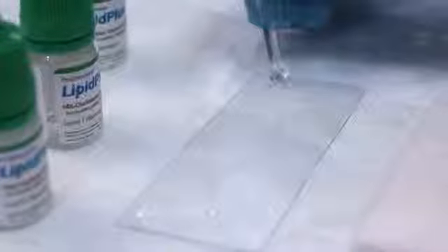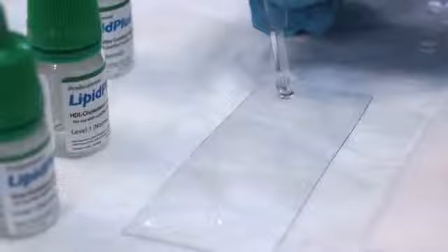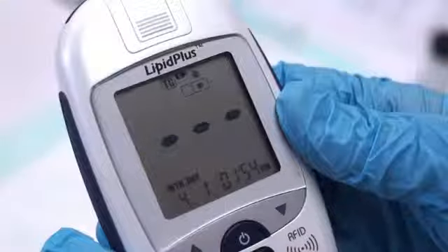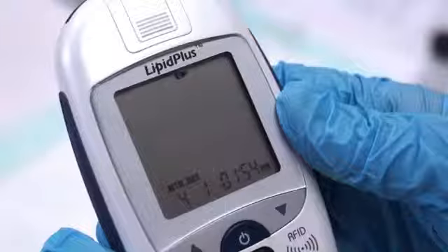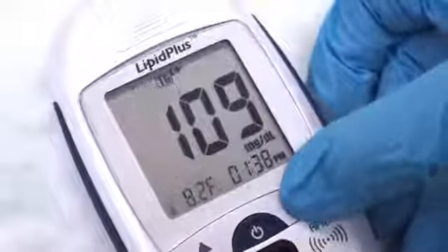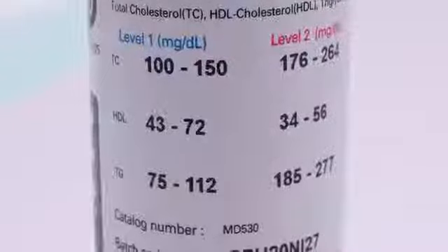The symbol for HDL will then disappear from the screen. Using a new capillary rod, apply the triglycerides control solution to the triglycerides test area of the test strip until you hear a beep. The symbol for triglycerides will then disappear from the screen. The test results should appear on the screen in about 2 minutes. They should be compared to the ranges for each level printed on the strip vial.